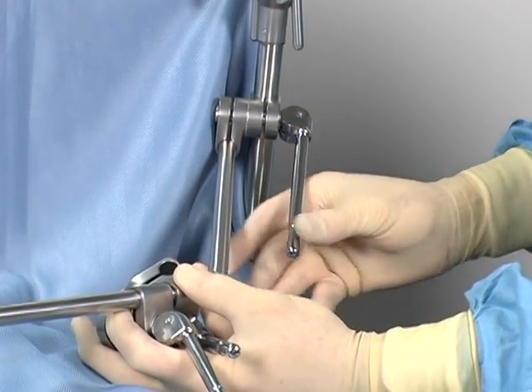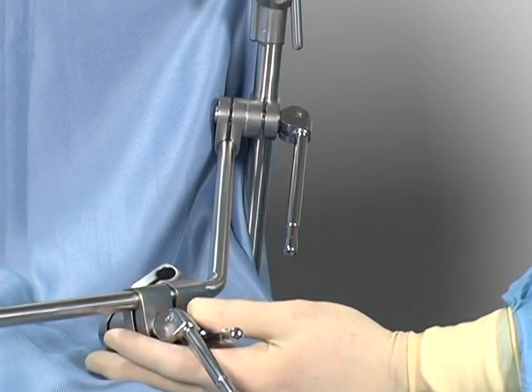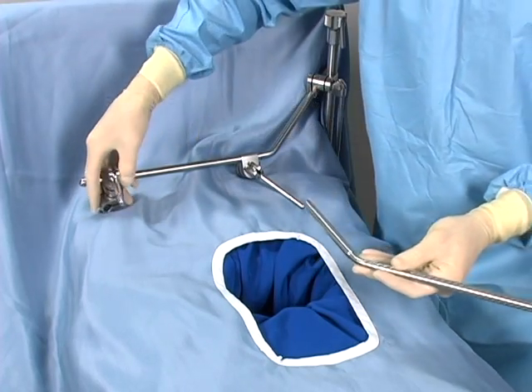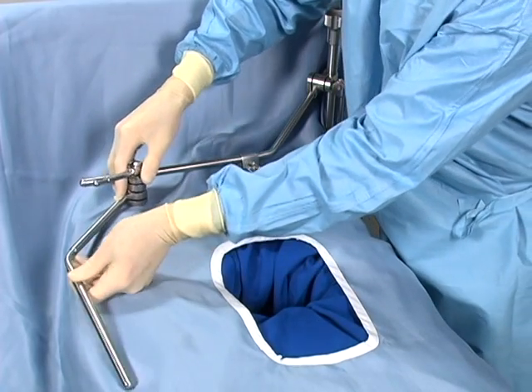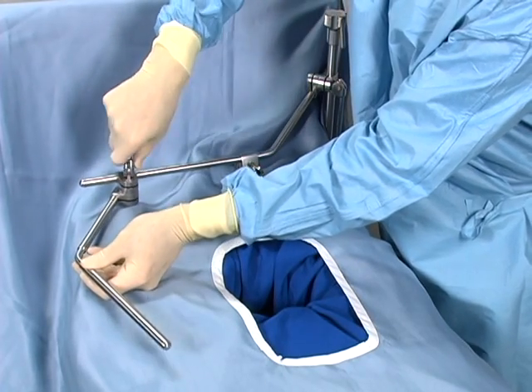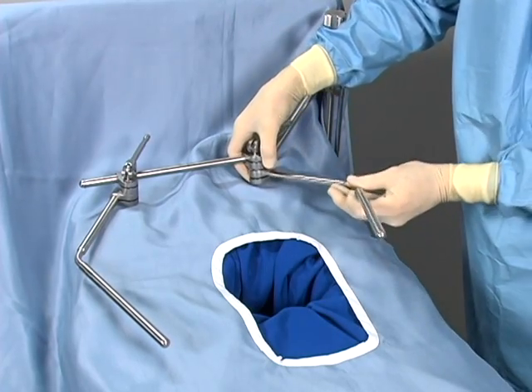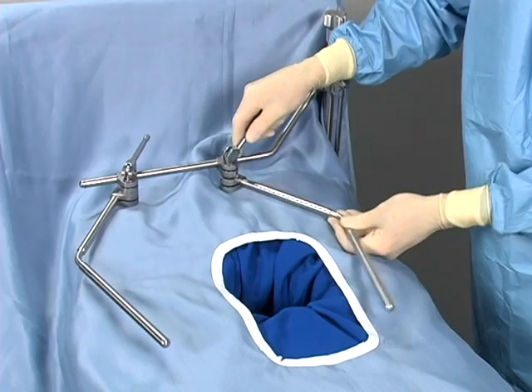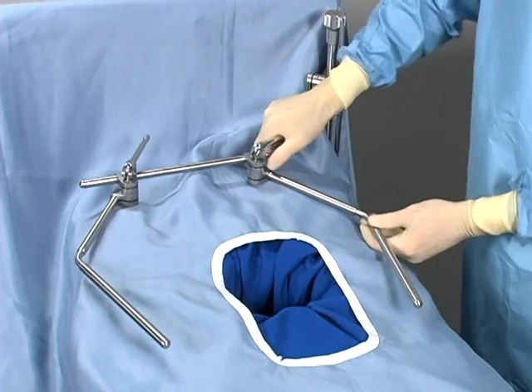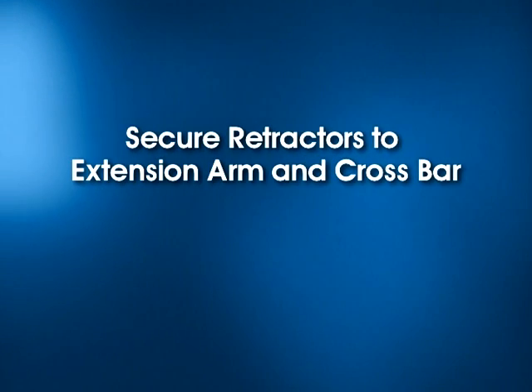For additional leverage, place the cam joint's handle over the arm and grasp the arm while locking the joint. Secure the extension arms to the crossbar. Position the arms just above the horizon of the patient. The height of the arms can be adjusted independently to facilitate retractor placement for towing under, elevating, or pulling down on the margins. Be sure to leave enough room between each arm and the incision for retraction. A quick flip of the handle instantly secures the cam joint, locking the arm in place.